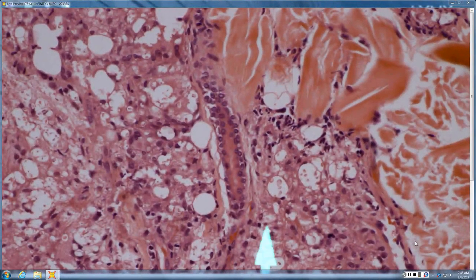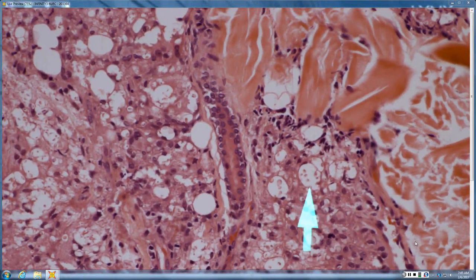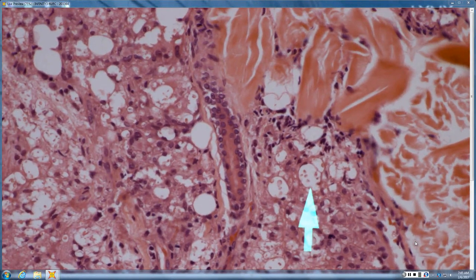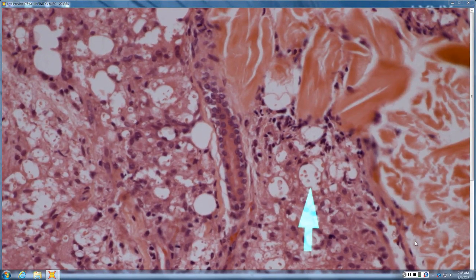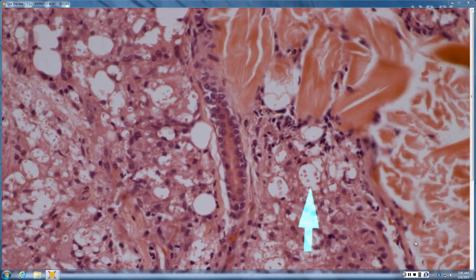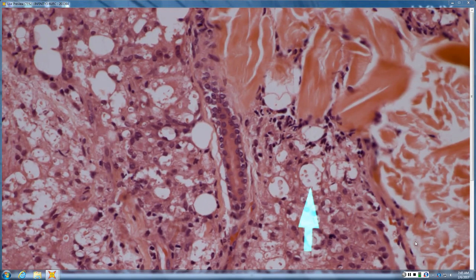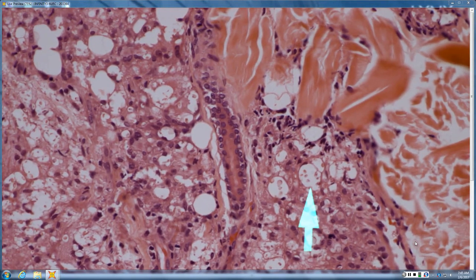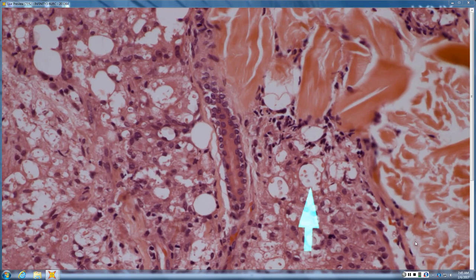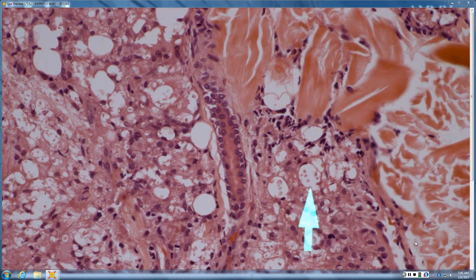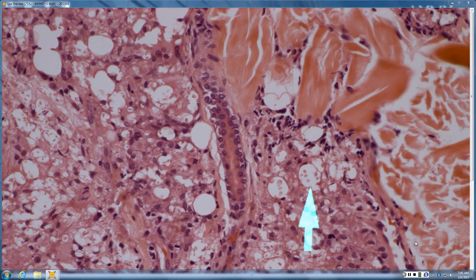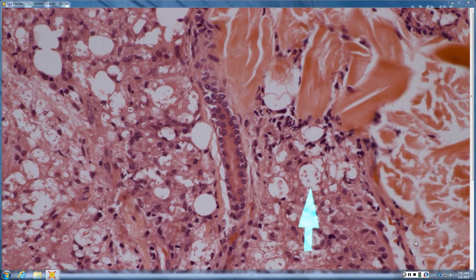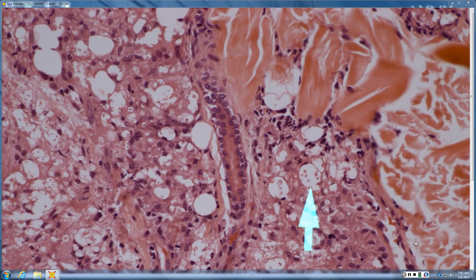So, James, what do you think? Cryptococcus. Cryptococcus. Why crypto? Because there are many organisms in a gelatinous condominium of different sizes characteristic of cryptococcus. Very good description. So, crypto can be granulomatous or gelatinous. Gelatinous is more common.